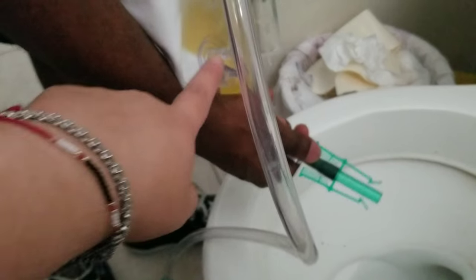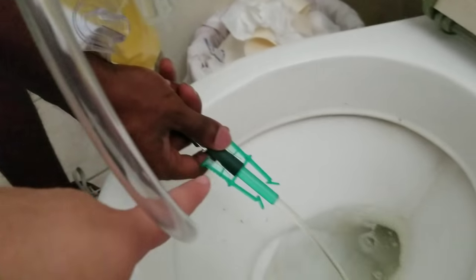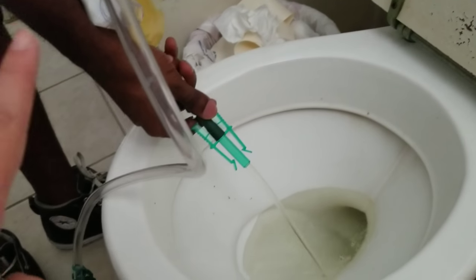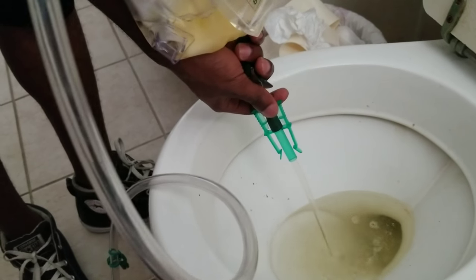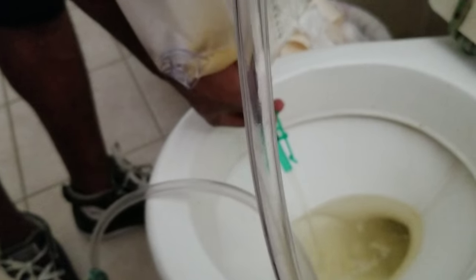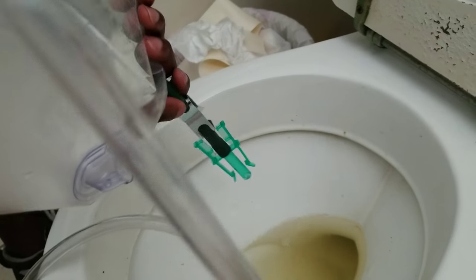All right, so this part right here — this green part — it goes in here, so there's a clasp right here, and you just unclip it, and then all of the urine goes into the toilet, obviously. And then that's it — you just drain it like that, and then flush it. The clasp itself, once you're done emptying it out, you just push it back so that it no longer allows urine to come out.